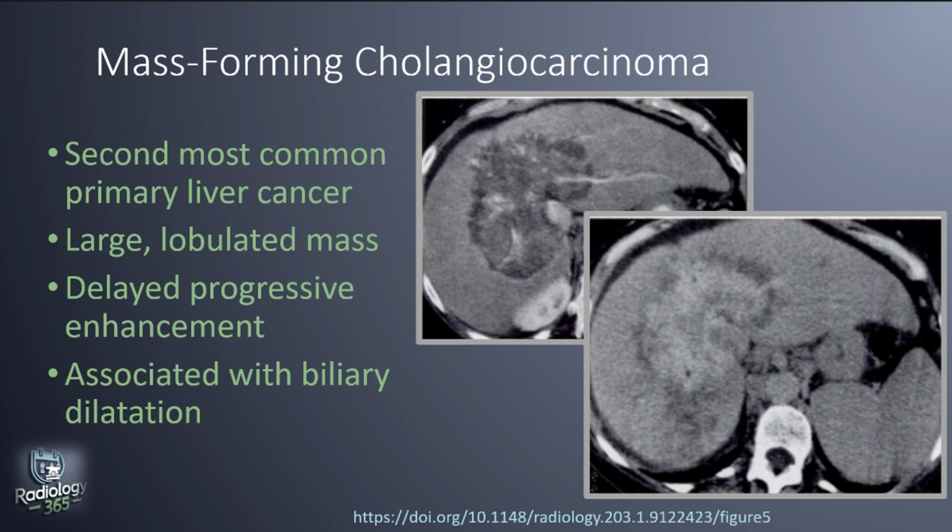They don't light up on the arterial phase like hepatocellular carcinoma, and the delayed phase of imaging, which is usually 2 minutes post-contrast administration, might not even show enhancement, but you would have to wait about 10 minutes post-contrast administration to see the enhancement of these cholangiocarcinomas.